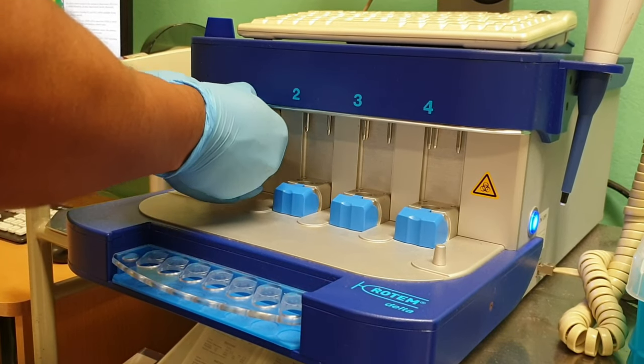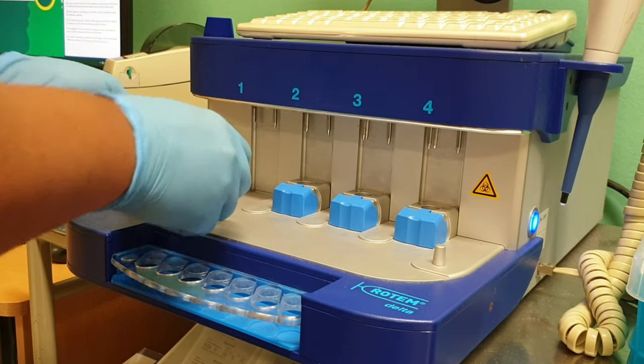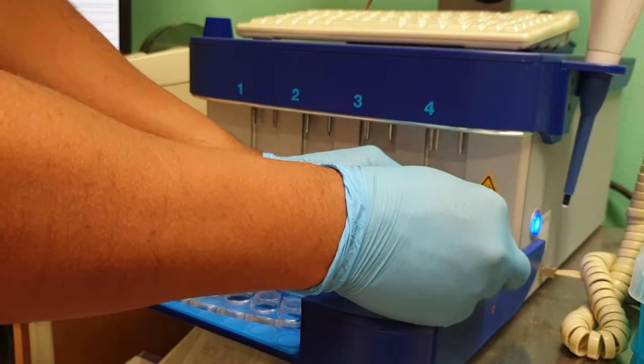It's good to clean up after yourself. Pressing the blue handle upwards detaches the cup and pin, and then you can dispose of it accordingly.